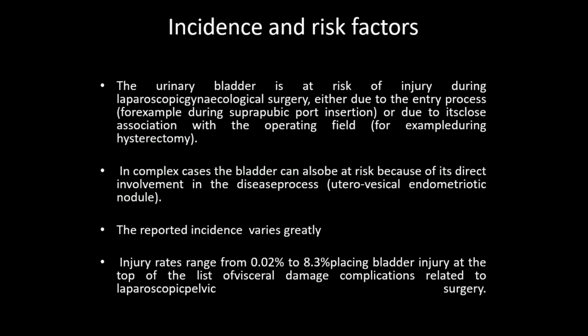Is the voice coming back? Okay, perfect. This was just a drop in the network. So it's very important to follow up the patient post-operatively very carefully, exactly as those patients of laparotomy. Most of us think about laparotomy as a critical procedure with more complications. But definitely, laparoscopy is associated with hidden problems that may present later, and then the problem will be more difficult to manage.